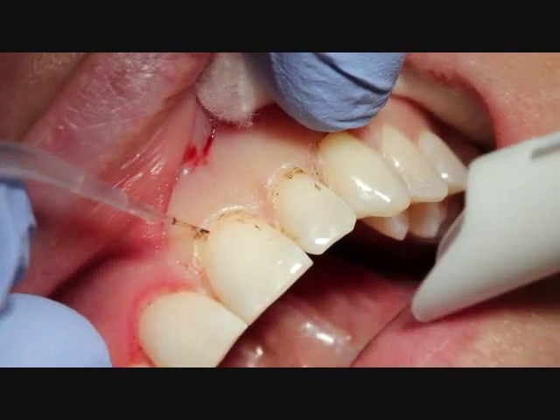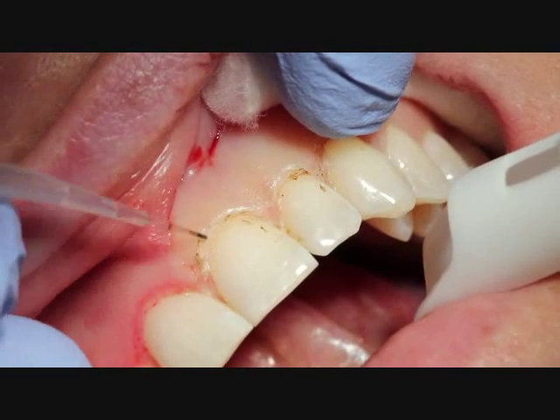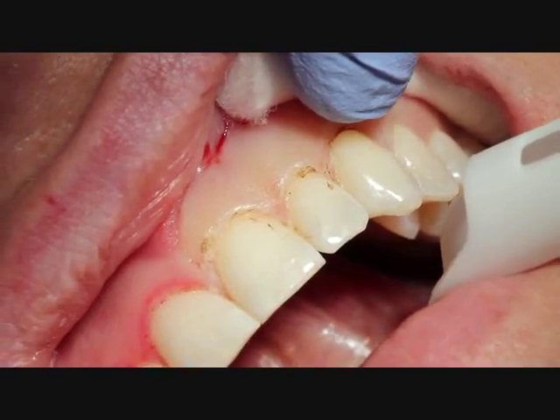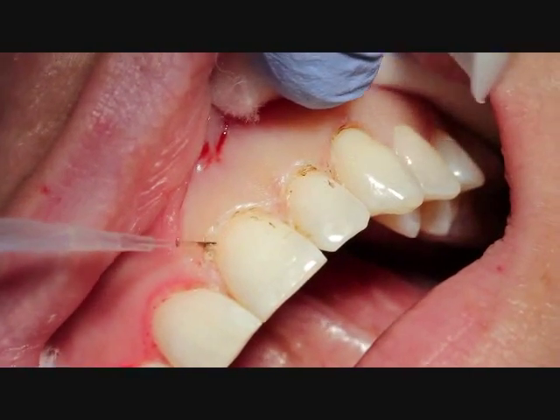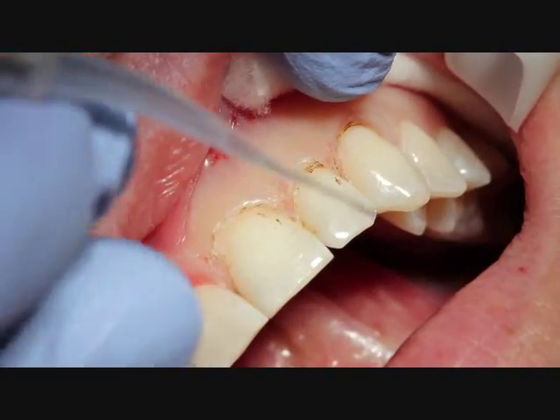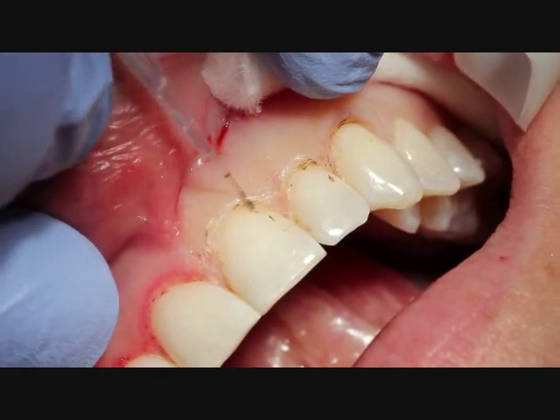You can see that after 24 hours, the healing is very nice. There's a little redness, which is to be expected. The post-op for the patient was to gently brush the area. And now we're just going to try to match up the left anterior teeth to match the right side that was done one day prior.